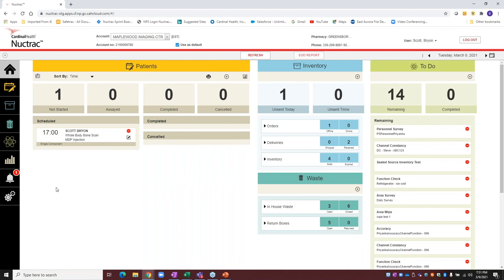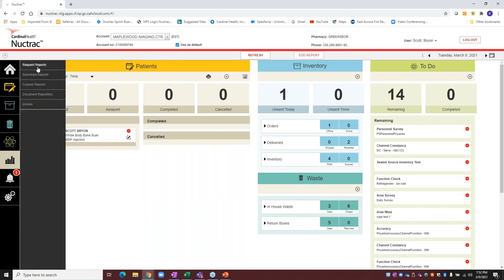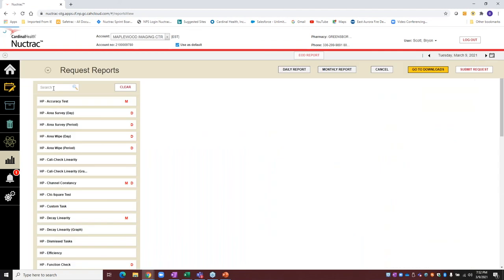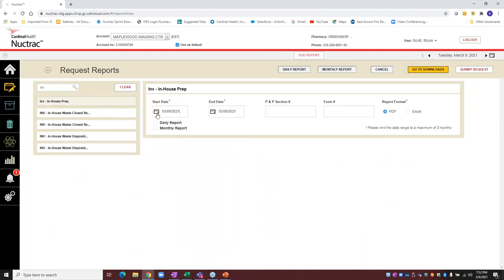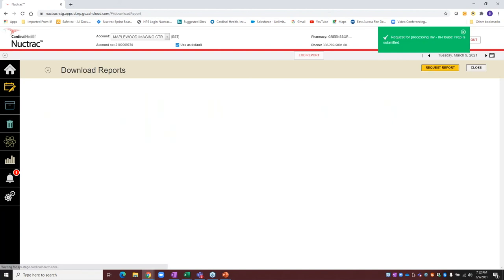Last but not least, and I know Rich talked about this and we don't want to brush over this: this stuff did not occur if you do not have documentation for it, right? So at the end of the day, you need to make sure that when you're all done, you have a report that can print out all the information that you just had. You may want it today, you may want it tomorrow, you may want it 6 months from now. But the system can store and hold those records for long periods of time until you're ready to pull those records.